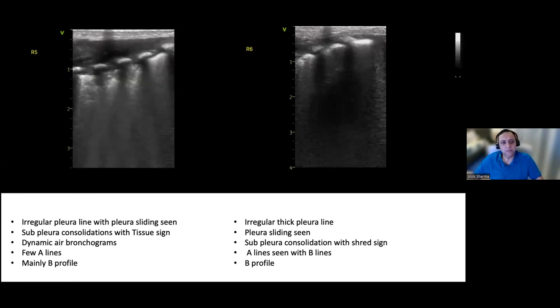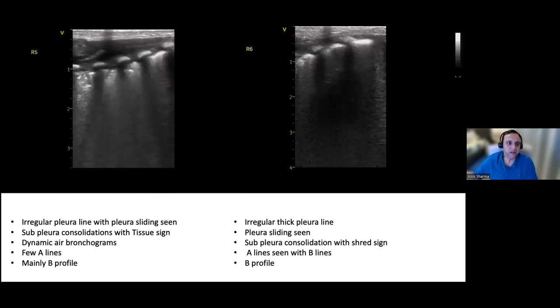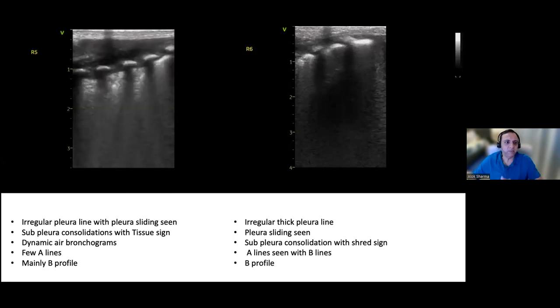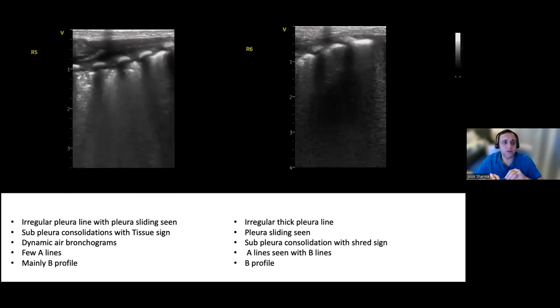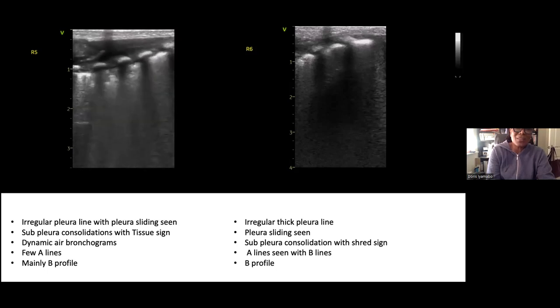You've got really good depth up to 3.5, and you've basically got subpleural consolidation with a pleural line that's not delineated, which would say to me that there's a combination of consolidation and atelectasis in that region. And R5 looks pretty bad. It's a beautiful image. I know how difficult it is to do R5 and R6 in that situation. So well done. Can I describe this as tissue sign also or not?